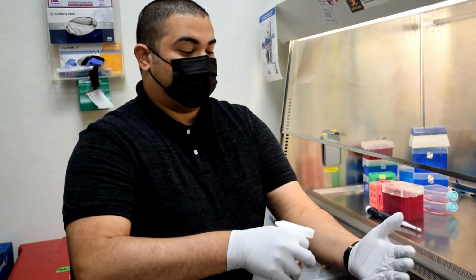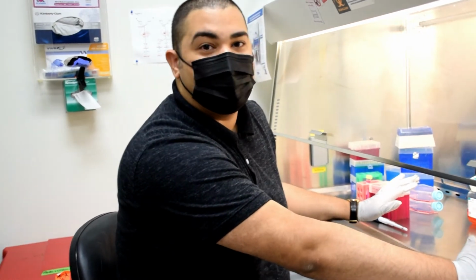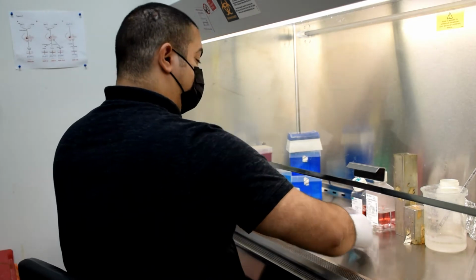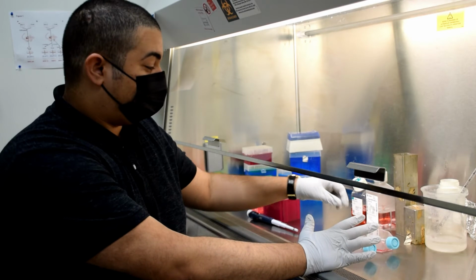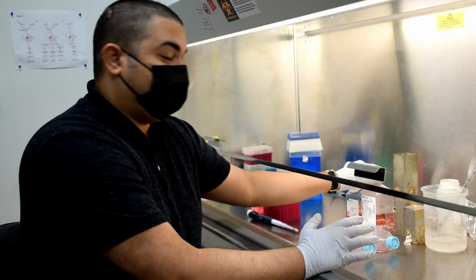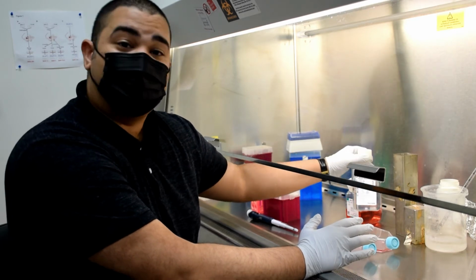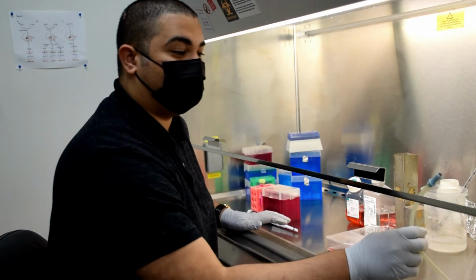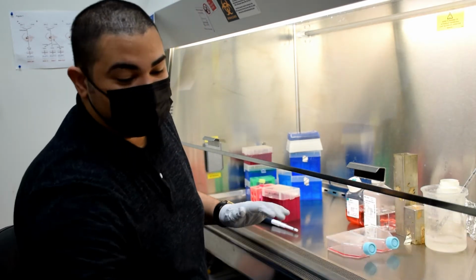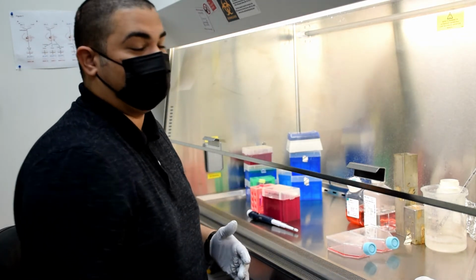So essentially we're going to get started. I'm going to be spraying ethanol, making sure it's all good. And once I go into the hood, again, the most important thing for us to remember is to always maintain a sterile field. Now I'm going to be taking the flask that I've already prepared. Like I showed you, they already contain the media that's going to make sure that the cells grow. I have in here all the media that I need. I also need to make sure I wash the cells before I put fresh media on them, and this is what this buffer is for. We also have our vacuum trap going here, which is going to aspirate off the old media that I want to take out. We also have pipettes, and for example this pipetter gun, which again, I made sure is disinfected. And we're going to go ahead and grab the cells real quick.